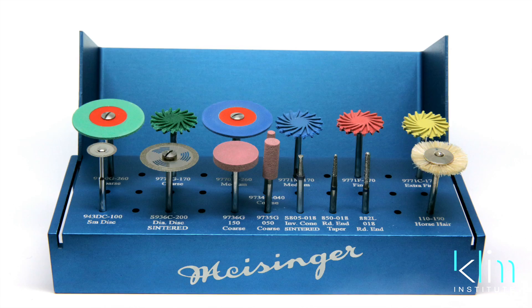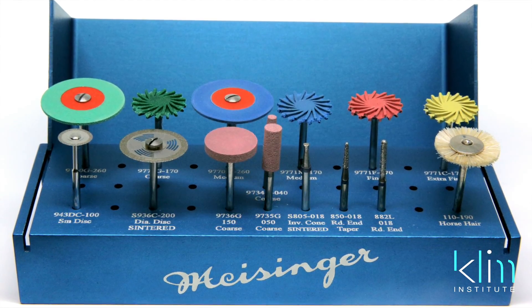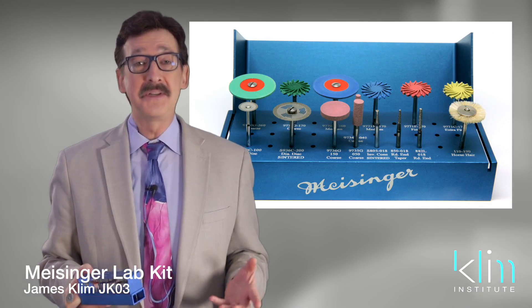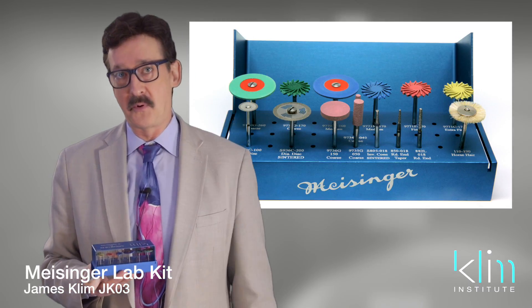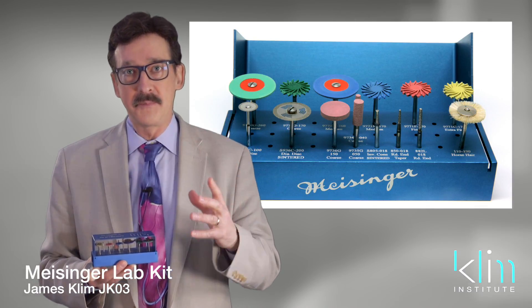I want to talk about the Klim Institute CAD-CAM Lab Kit by Meisinger. I want to thank Meisinger for providing such exceptional quality of burrs — they're just a really good company. They have really nice people there and they're a lot of fun to work with. They've been so supportive, and I love the quality of their instruments.